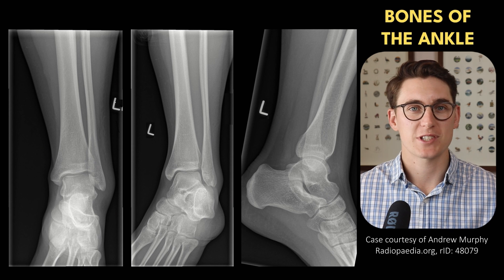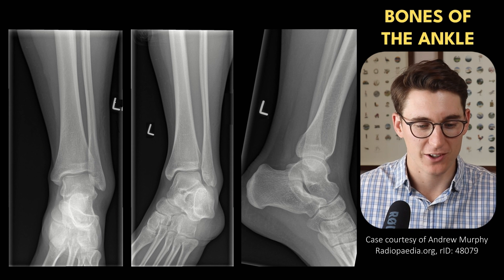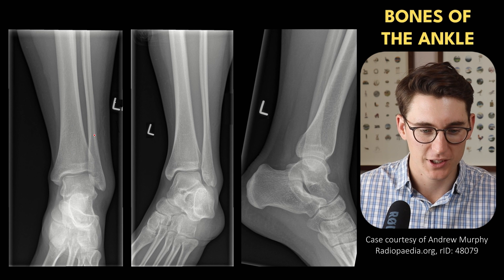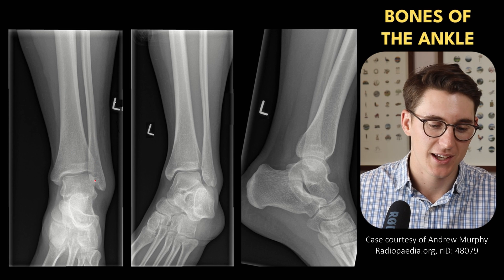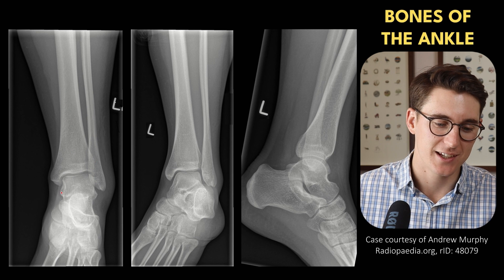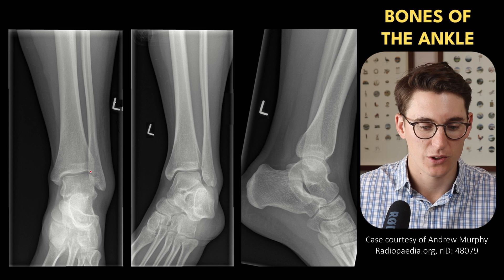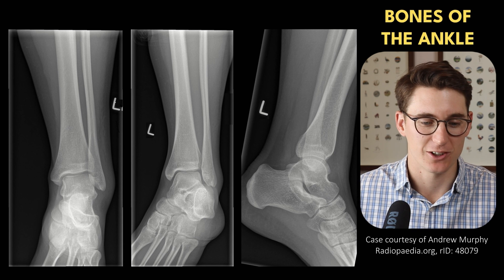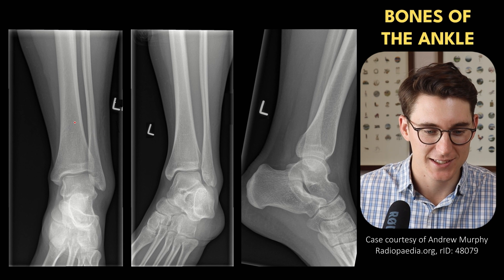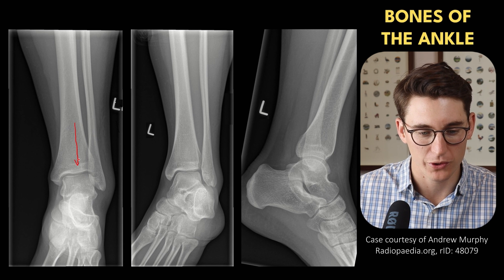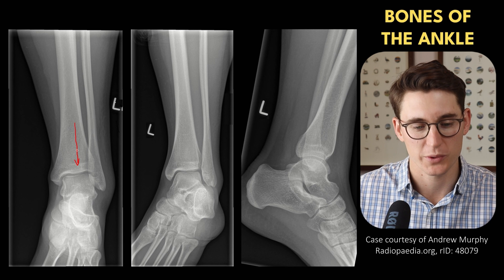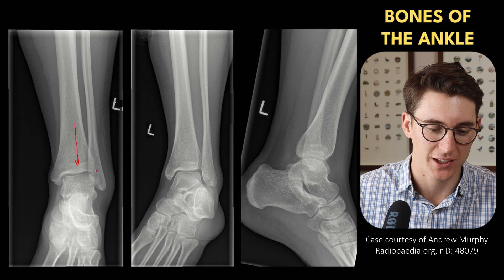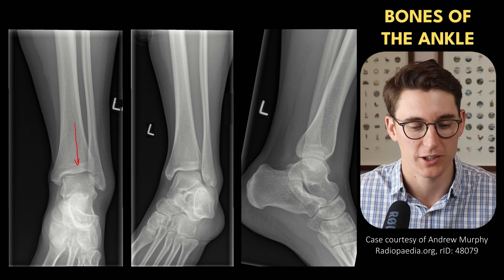Now there are actually only three bones that make up the ankle joint. We have our tibia here, our fibula laterally, and our talus of the hind foot. You can start by having a look at the tibia itself. We can see that the tibia is the main weight-bearing bone out of the two — there's not much weight-bearing happening through the fibula.